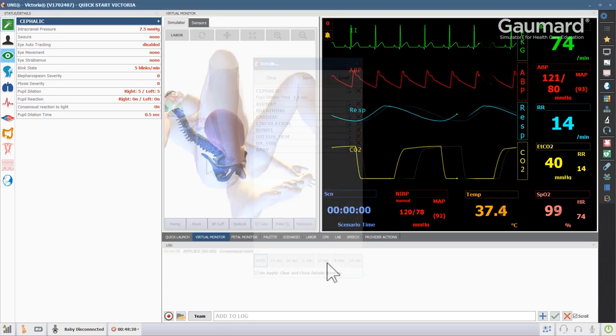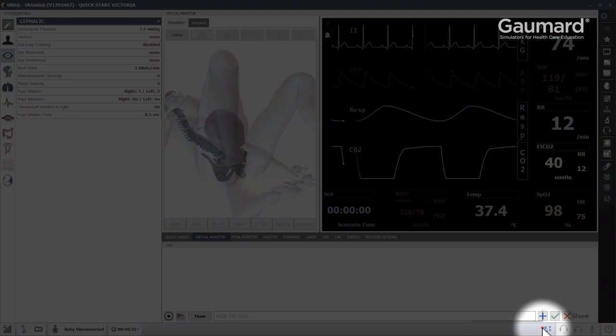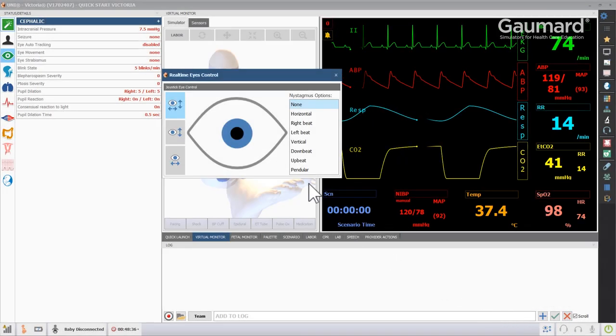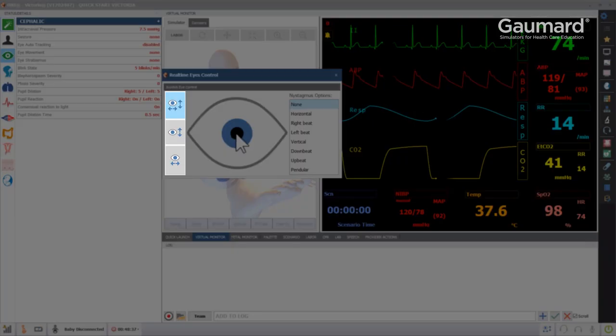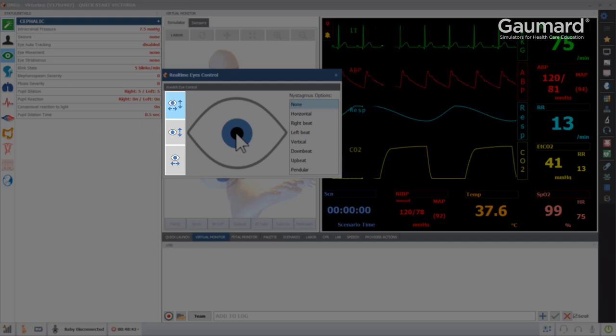The joystick eye control panel allows you to take more real-time control of the eye movements. To open the real-time eye controls, click the eye icon in the lower right corner of the software. In the joystick controller, you can move the eyes by clicking and dragging the pupil to any location after clicking the free movement button on the left.